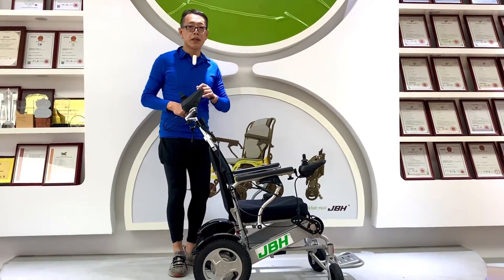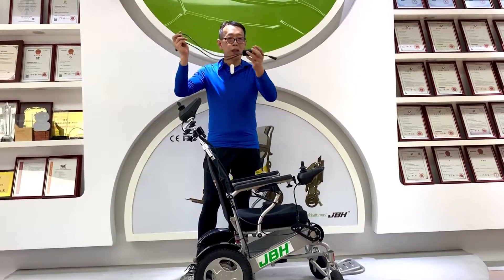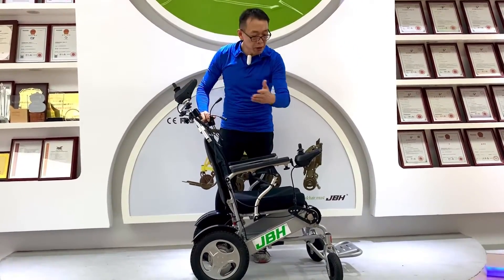Hello, my name is Kevin from JBH. Today I'm going to introduce a very powerful connector that allows you to connect two joysticks.